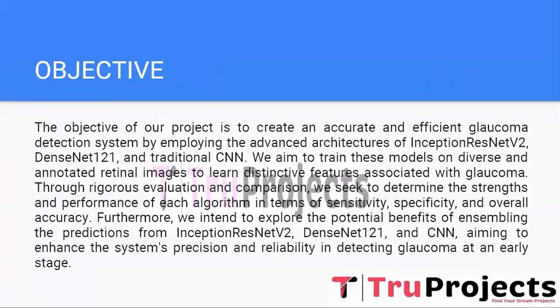Our primary goal is to develop a precise and efficient glaucoma detection system by utilizing advanced architectures such as Inception ResNet V2, DenseNet 121 and traditional CNN. These models will be trained on a diverse set of annotated retinal images to learn unique features associated with glaucoma. By rigorously evaluating and comparing the performance of each algorithm in terms of sensitivity, specificity, and overall accuracy, we aim to identify the individual strengths.